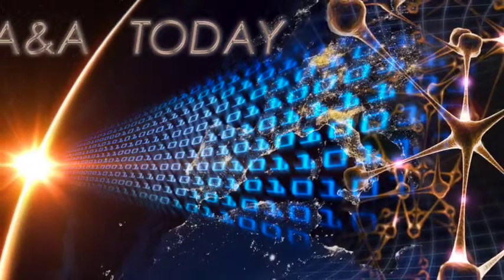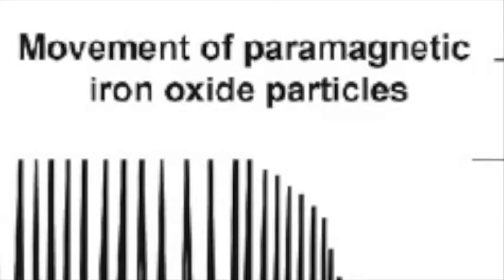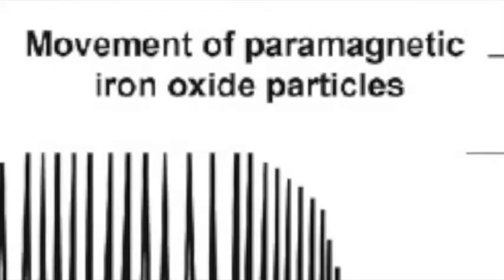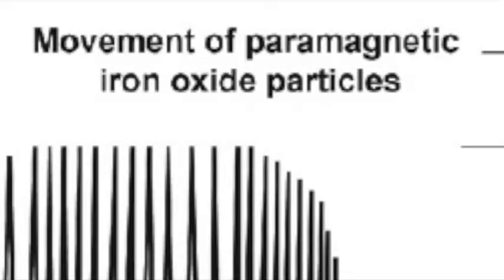Richard Dutton. A more rapid measure of fibrinogen, a system similar to thromboelastography. For patients undergoing cardiopulmonary bypass, measures of fibrinogen can guide hemostasis therapy. Typically, fibrinogen assays take 30 to 60 minutes, during which therapy may be delayed.